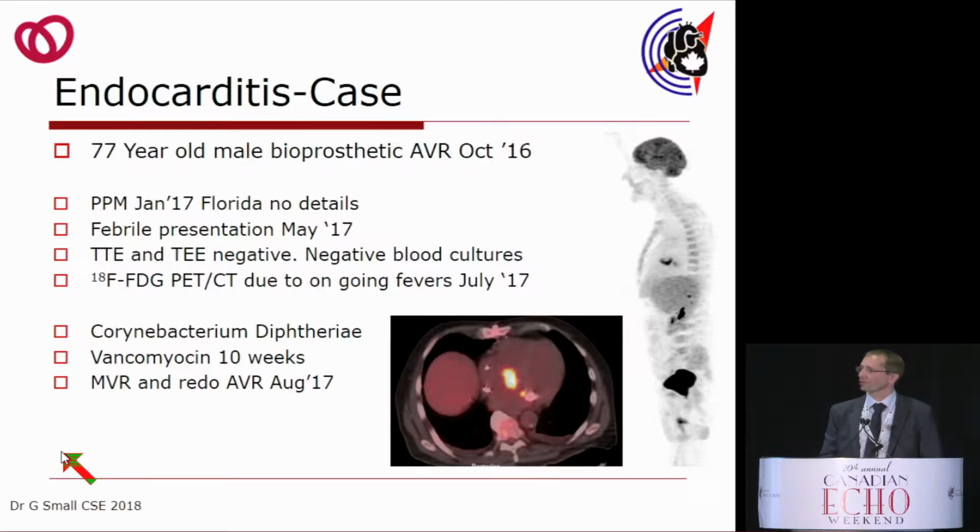And what that showed is shown here on the left-hand side. And I know that many of you may not be as familiar as some of you are with these images. So let me just talk you through what we see here. So this is a whole body FDG. I've shown the patient in profile so that we can identify a lot clearer where the FDG uptake is. Now the main metabolic substrate for the brain, at least hopefully even now at this time of day, remains glucose. The extra glucose is excreted in the kidneys, so we see the collection here in the kidneys and also in the bladder.